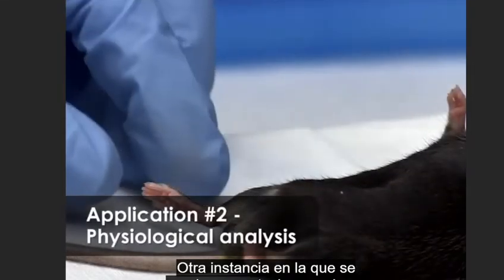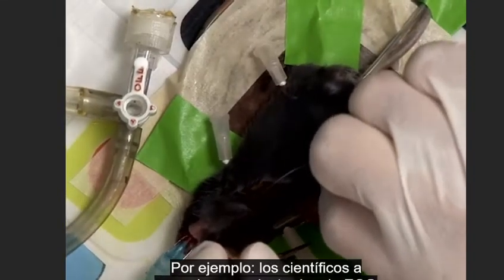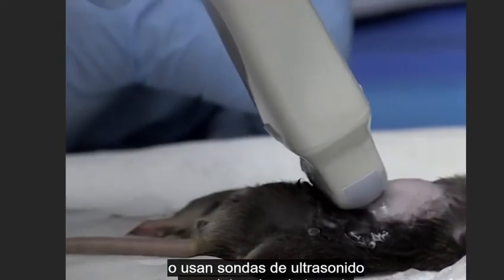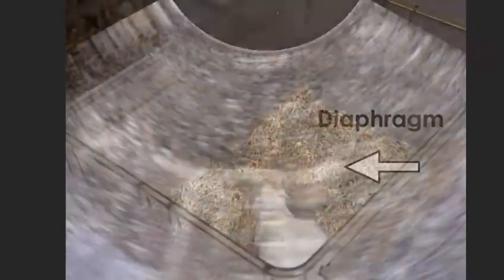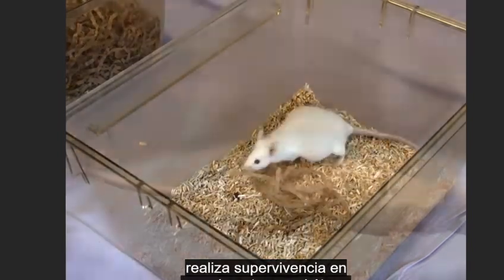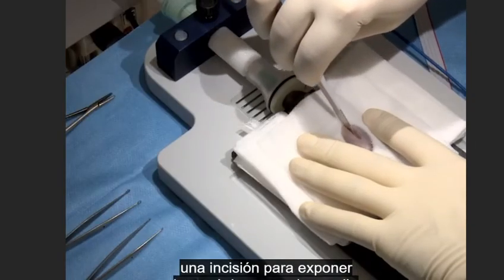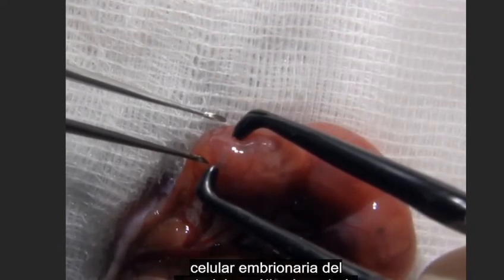Another instance in which rodent anesthesia is required is for performing physiological analysis. For example, scientists often use ECG electrodes on anesthetized animals to monitor heart activity, or use ultrasound probes to determine the rate of diaphragm movement to more accurately quantify the respiratory rate. Lastly, use of anesthesia is mandatory when performing survival in utero experiments — for example, in utero electroporation, a method in which a pregnant female is anesthetized, an incision is made to expose the developing embryos, and electrodes are used to induce embryonic cellular uptake of the injected genetic material.